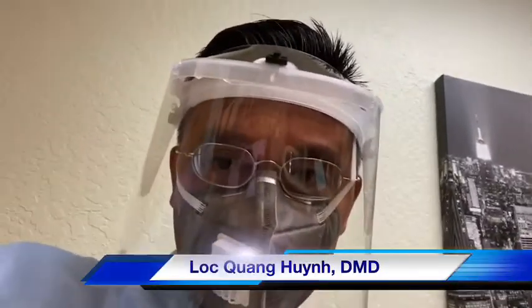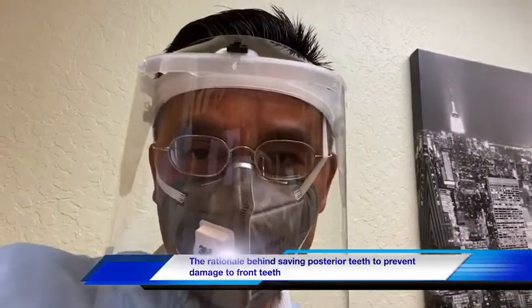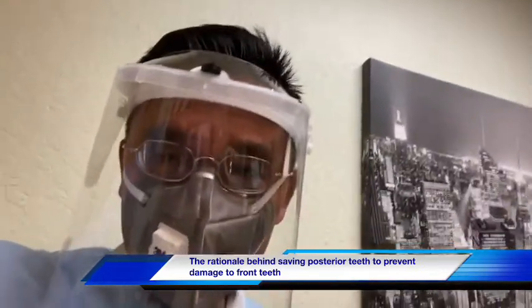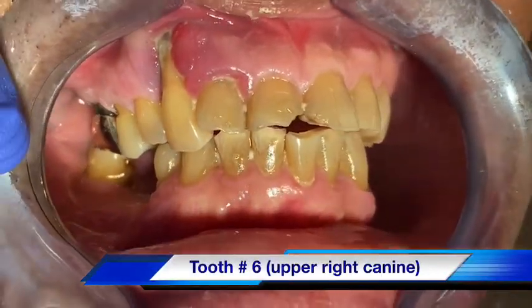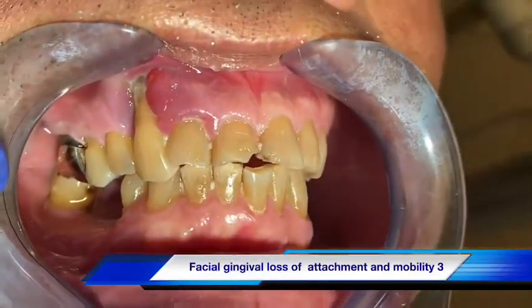Today I'll be talking to you guys about a very simple concept of occlusal trauma and localized advanced periodontal disease. In this particular video, you're gonna be seeing the X-ray, the occlusal view, and also the intraoral facial aspect of the case. This is tooth number 6.